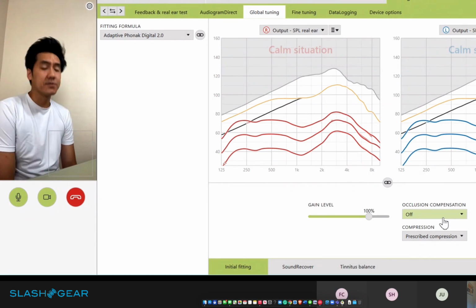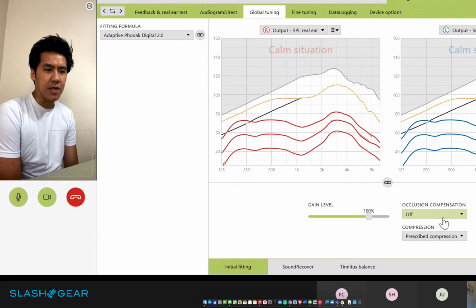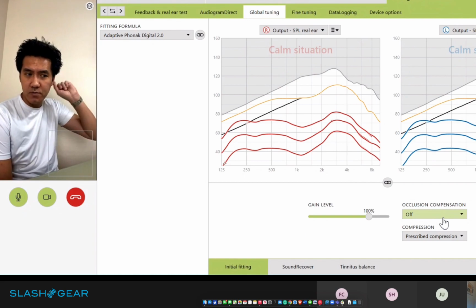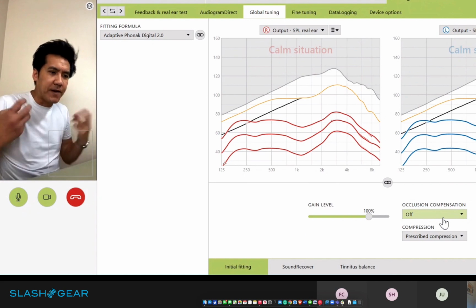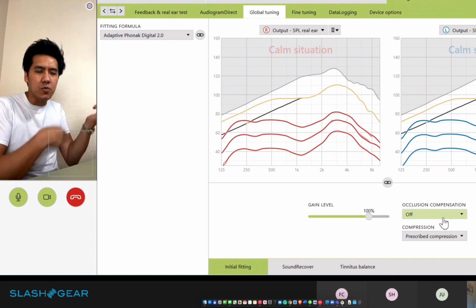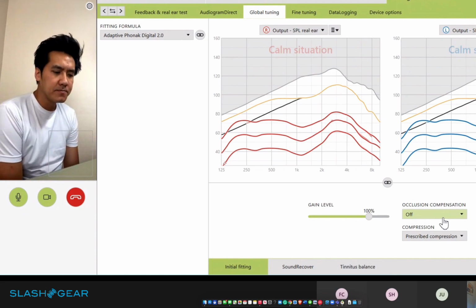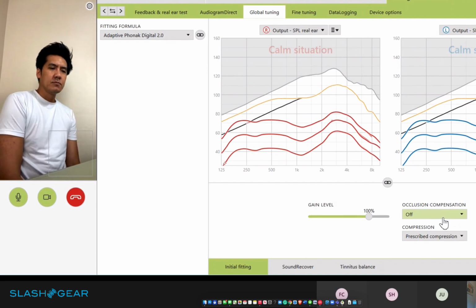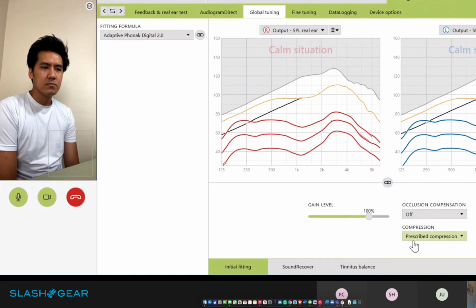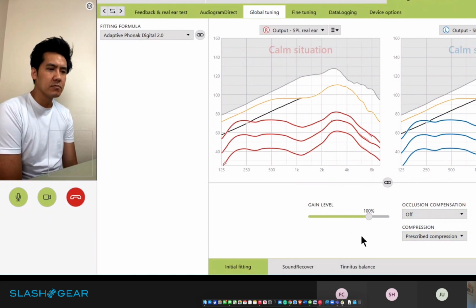Yes. A custom hearing aid? Yep. Custom hearing aids and custom earpiece with the receiver, and they always felt like I was closed up, and so that's why they weren't ideal with the Verto. Okay. So in this case, this is where we can also use that to help compensate for this feeling plugged up, but trying to relieve some of that. But in this case, I would not apply that because you have a dome fitting. Yeah. Perfect.